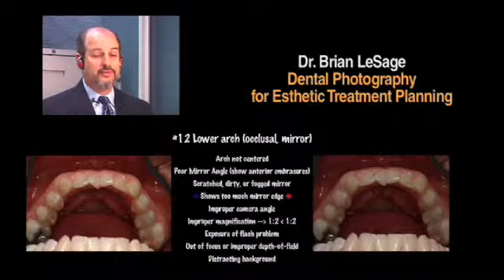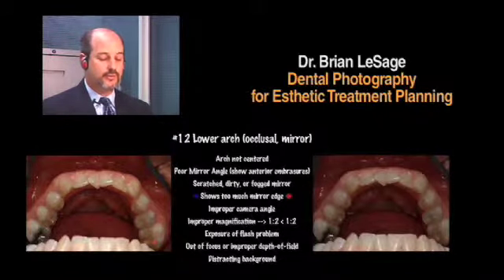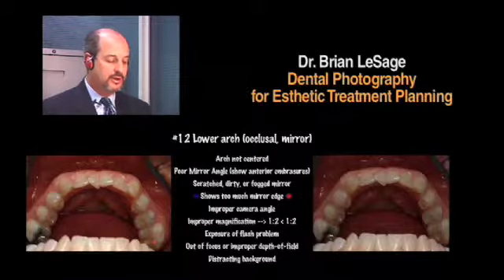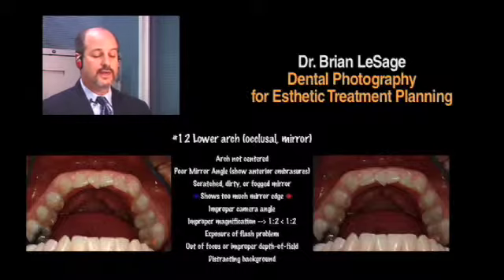That's why the photography really needs to be consistent. Now we're a little bit too far over the patient, and so we can see the whole facial plane. That's not really what we're looking for. So neither one of these is great. I would still call them acceptable, especially if you're shooting these by yourself. You're getting back to the first molar. You'd like to at least see the first molars. Ideally, I'd like to see a little of the second molar, but you want to see these facial embrasures because that's really going to help you in diagnosis and through treatment.